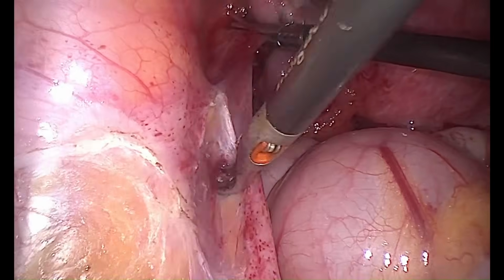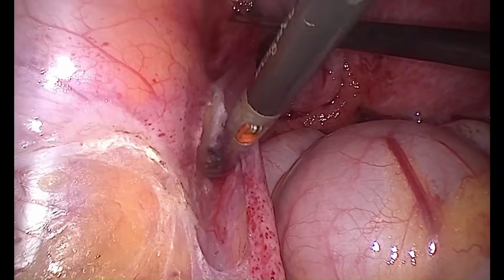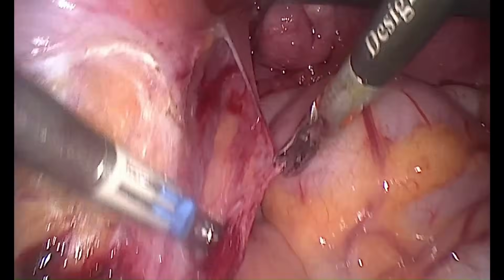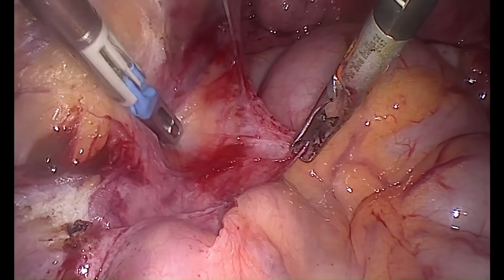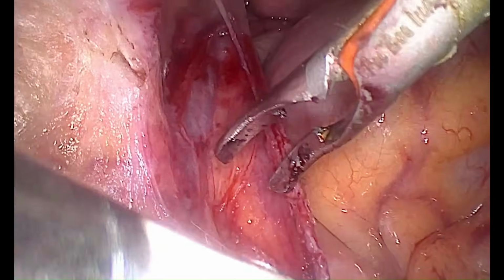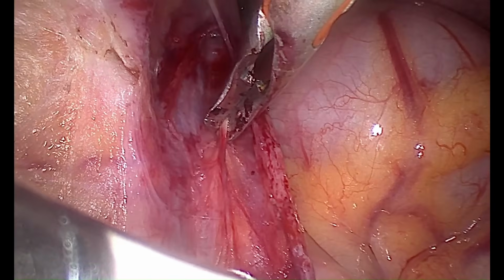This is the procedure where we are showing the ureterolysis. If you can see, ureterolysis is an important procedure in advanced endoscopic procedures like endometriosis, or maybe where there is a previous operation. You need to understand the retroperitoneal approach of ureterolysis.